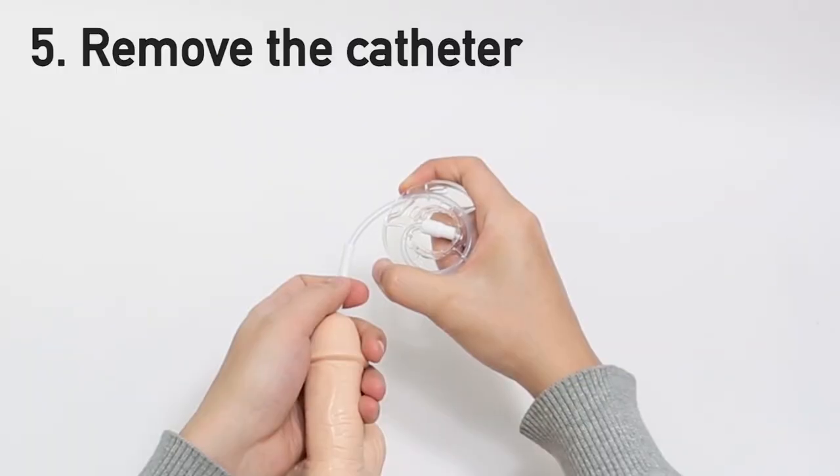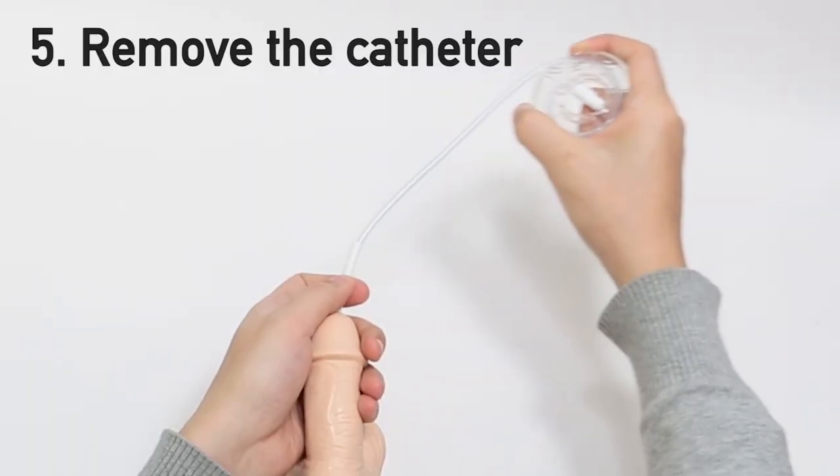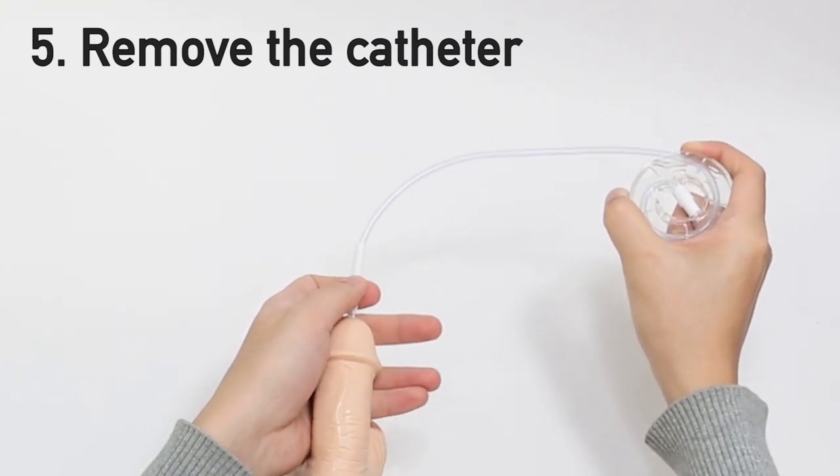Once the bladder is empty and you're done draining, slowly remove the catheter from the urethra.